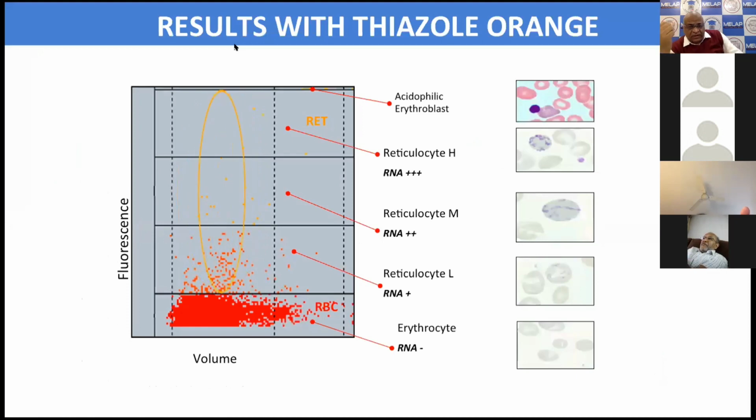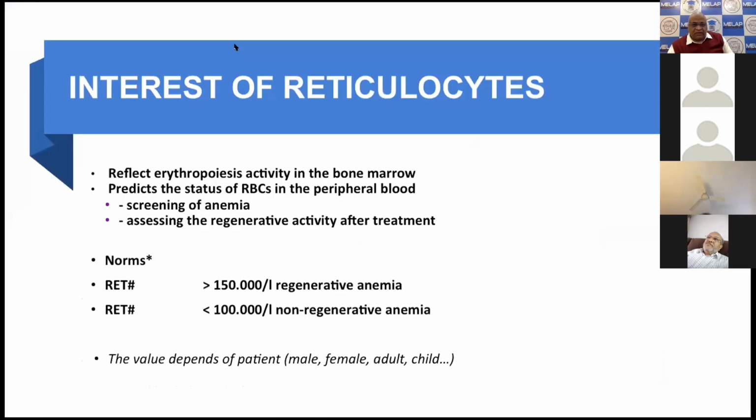If they are showing very high fluorescence, these are early forms of reticulocytes, then medium type, low type, and mature erythrocytes. So where exactly you are getting the shadow, with that you can decide, and in the retic preparation you get these types of cells. So you can correlate with the retic preparation, and with time you will get experience and be able to relate in a better way.